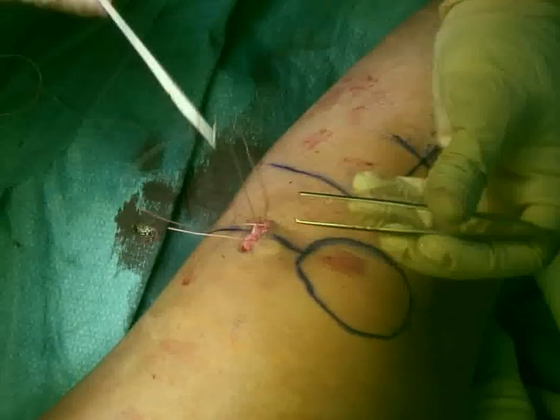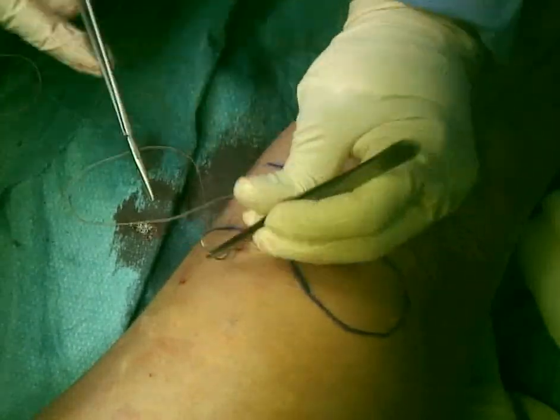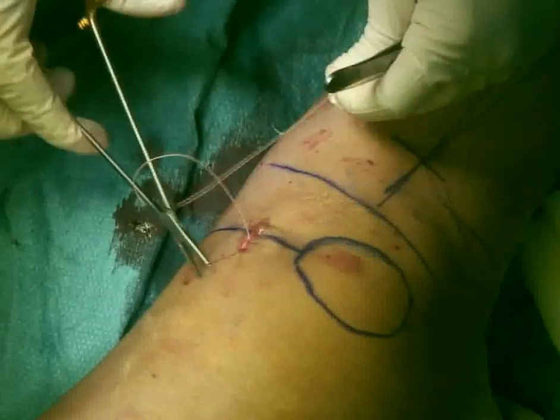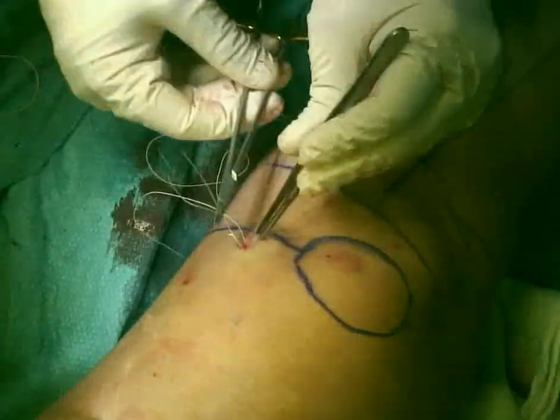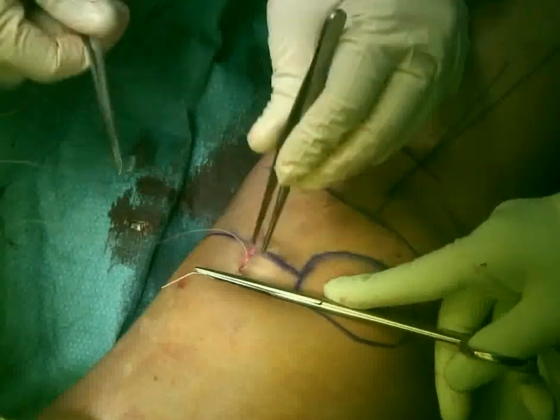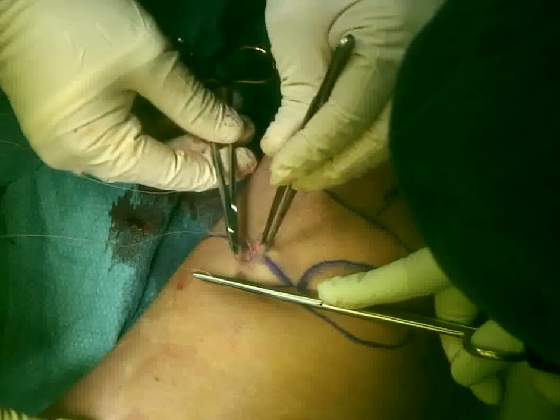Now the patient in the operating room, we did the preparation and draping before the surgery, and we did the left distal femoral hemiepiphysiodesis using an 8 plate, and now we are closing the wound. As you can see the marking, we mark the patella, we mark the distal femoral physis for the 8 plate, and also there's a horizontal line which is the proximal tibial physis, and there are 2 lines along the main axis of the proximal tibia and the distal tibia, and there's a small horizontal line where we think our osteotomy will be.